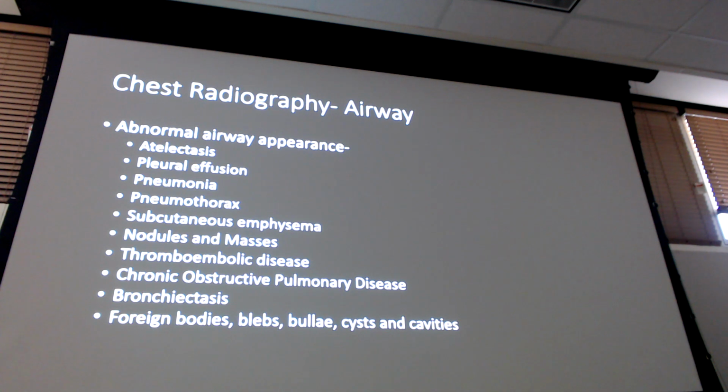So we covered some of the interstitial disease, we covered some of the alveolar disease as generalities to help you understand one versus the other, what it looks like, why would one be presented, why would one not, primarily with symptoms, how it looks on x-ray. That's an overarching umbrella of things, right? Very generalized.